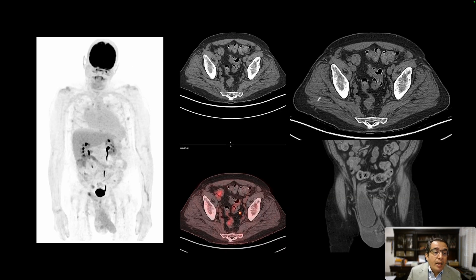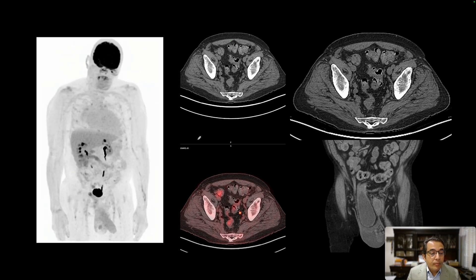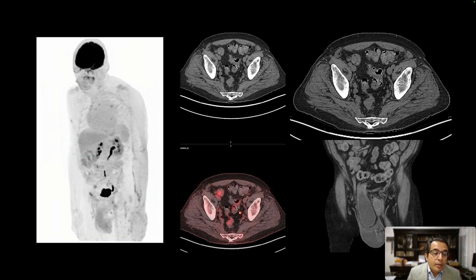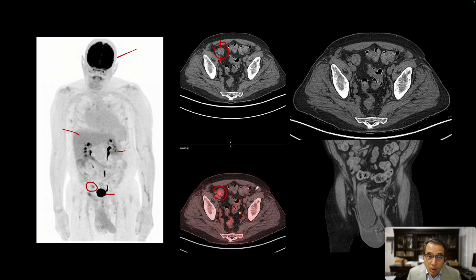Here is our next patient. They have a history of lymphoma and presented for a follow-up FDG PET-CT study. On the whole-body rotating image, we see physiologic uptake in the brain, liver, and excretion from the kidneys into the urinary bladder. A notable focus shows a heterogeneous soft tissue density with possible internal fat and ill-defined mild hypermetabolism. We initially considered whether this could be a lymph node with hypermetabolism representing recurrent lymphoma.